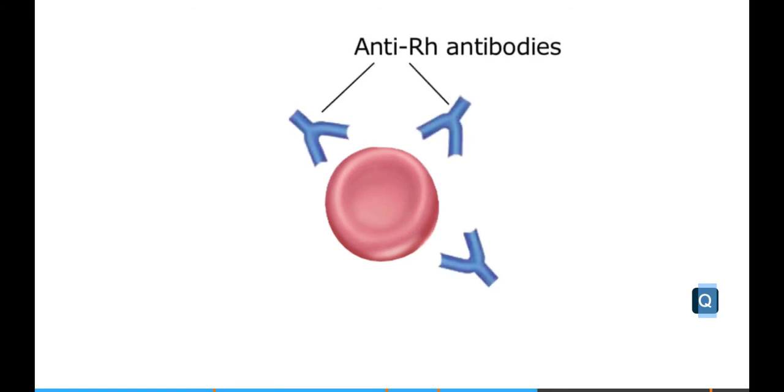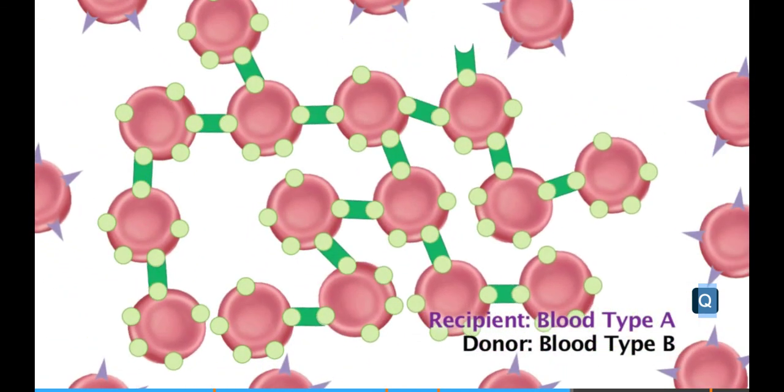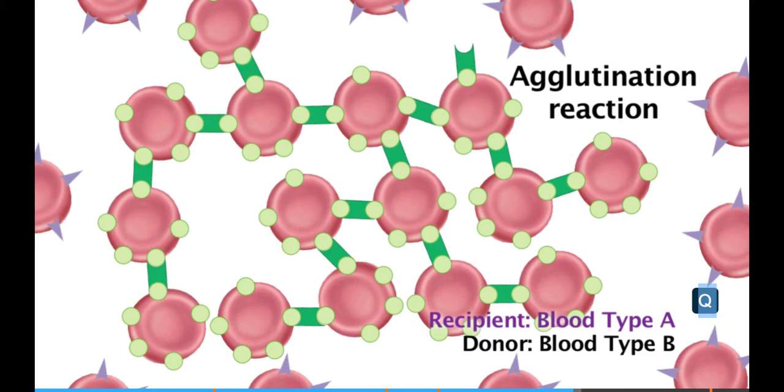the screen. Unlike the A and B antigens, antibodies against the Rh antigen only appear in the blood for an Rh negative individual who has been exposed to Rh positive blood. Pregnant women must be blood typed to know if they are Rh negative. If a mother is Rh negative, measures must be taken to prevent complications that could arise for a fetus that is Rh positive. The blood typing procedure, as we'll see in this lab, requires the observation of agglutination reactions.